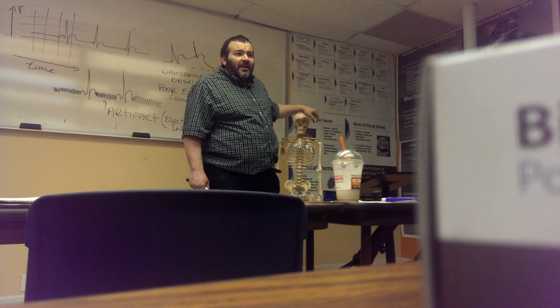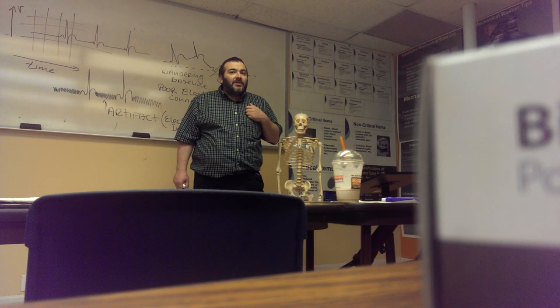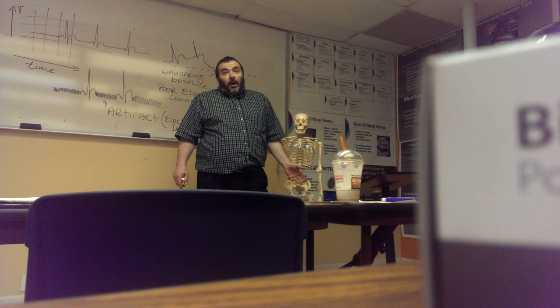And you take their EKG. Make sure you're very specific about what you tell them as you do the EKG. Please don't tell anyone, okay, we're going to do an EKG, so go ahead, take off your clothes, lie down on the table. You show up back in the room, they're buck naked. Hello? Well, I just did what you said.